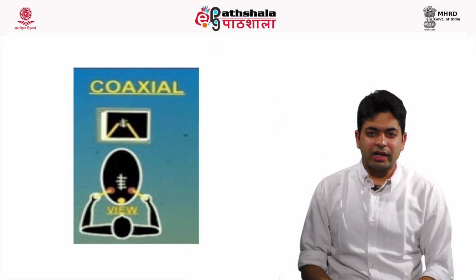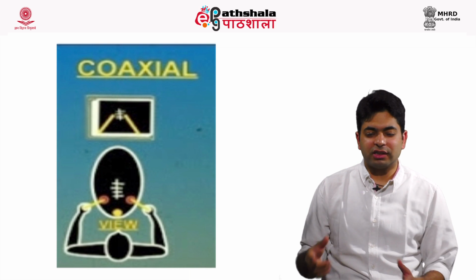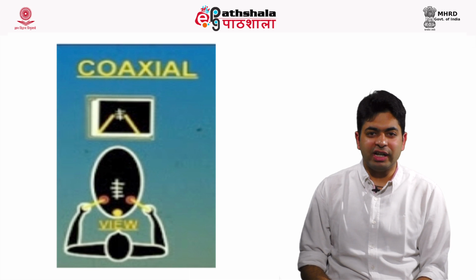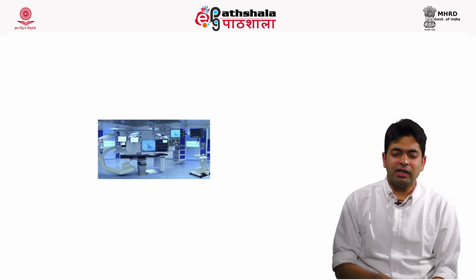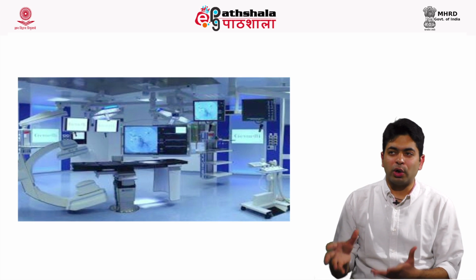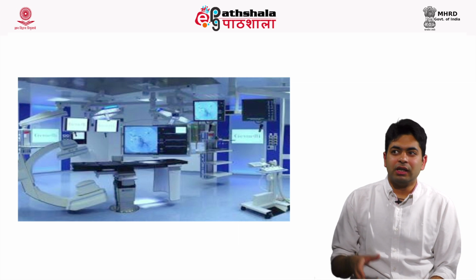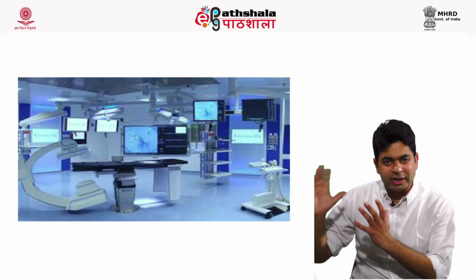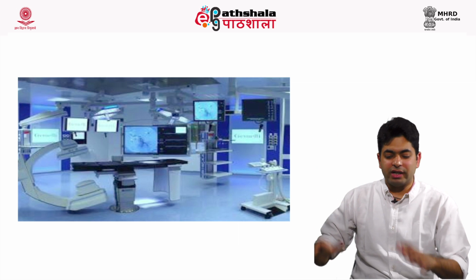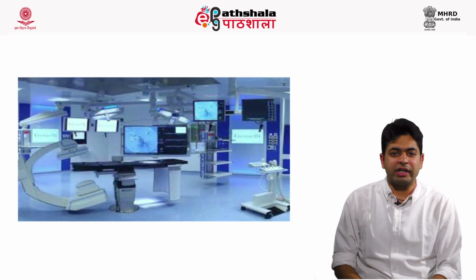Now the diagrams that are in front of us, I would like to show you the first diagram, that is showing the surgeon operating in the laparoscopic field and the panel is right in front of him. This is known as the coaxial view. The second diagram that you can see is of a modular OT, where most of the panels and the C-arms are mounted from the ceiling so that they could be moved from place to place, height could be adjusted, and the floor is all empty so that movement of instruments and trays could also take place there.